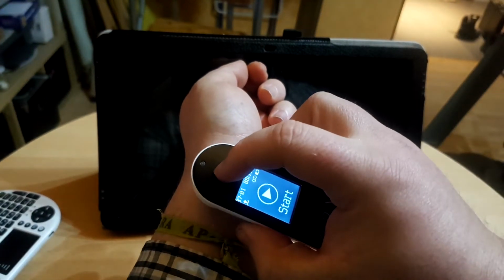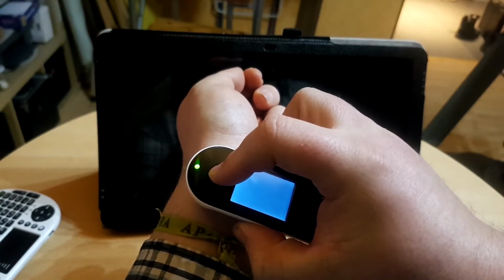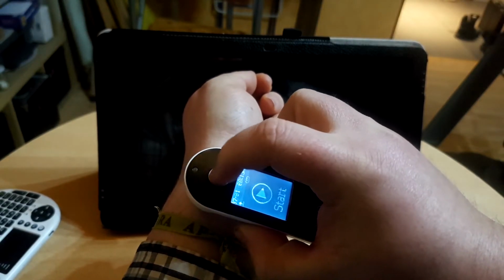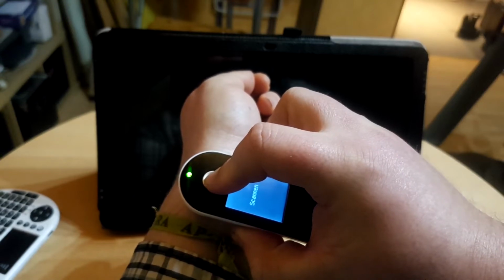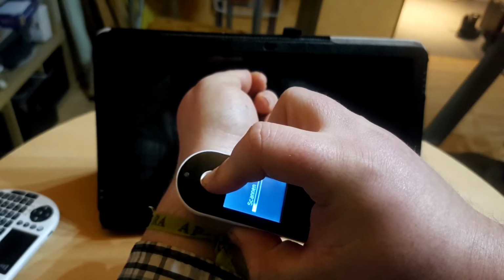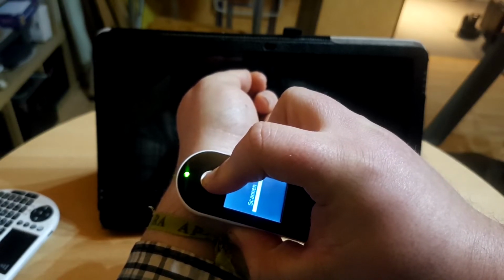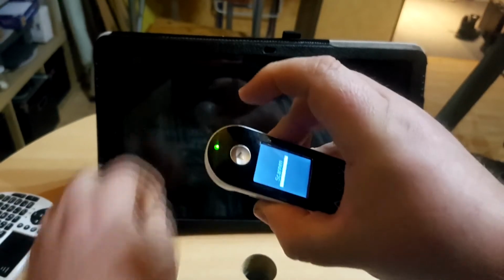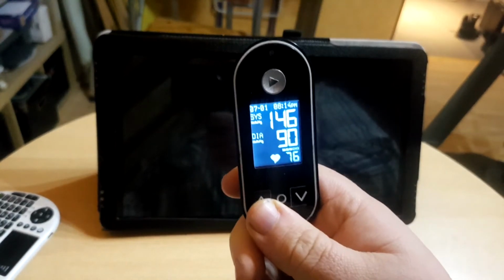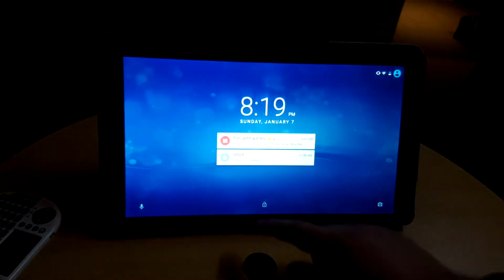You put it in here. Oh, brilliant, we can see that right here happening. You put that in here. As I said, it sometimes is a little bit wiggly, but usually it works out of the box. And you see here, 1, 2, 3, 4, 5, 6, 7, 8, 9, 10. And here we go. We have 146/90, and let's pretend that we actually wanted to have that for this video.